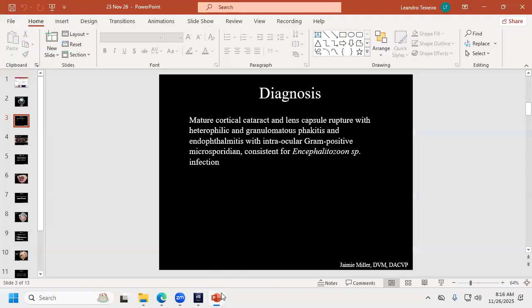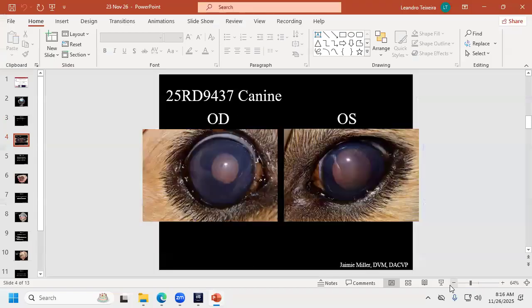And then I think just to finish up, the lens also had some cataractous change here. The posterior portion of the lens capsule is thin, and then we have posterior migration of our lens epithelium. Then we have some degeneration, liquefaction, and Morgagnian globule formation of the lens fibers here. So some early cataract formation. Again, findings were similar in both eyes, so I'm not going to show the other eye.